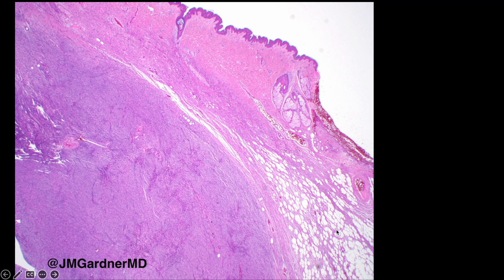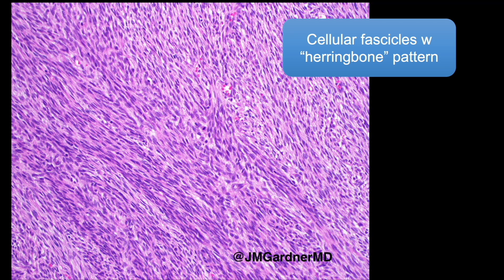Here you can see the classic honeycomb pattern trapping fat in conventional DFSP on one side, and then a sharp cutoff where there is a big nodule of hypercellularity. At higher power, those cells show a herringbone fascicular pattern — fascicles that are cellular and intersect at acute angles, giving a herringbone or chevron pattern. The cells are bigger, more plump, and have more mitoses than the thinner cells of conventional DFSP, but they are still usually not pleomorphic.